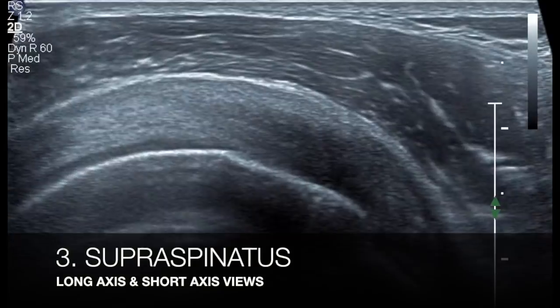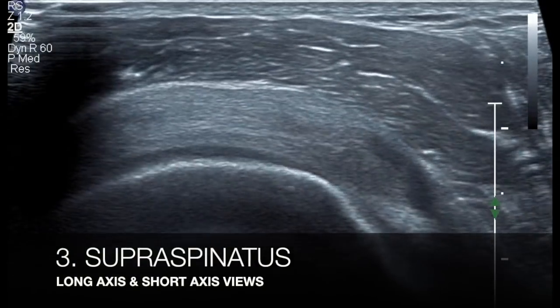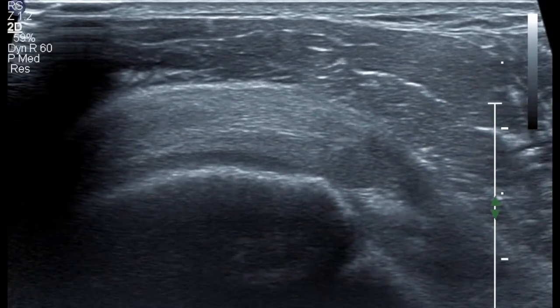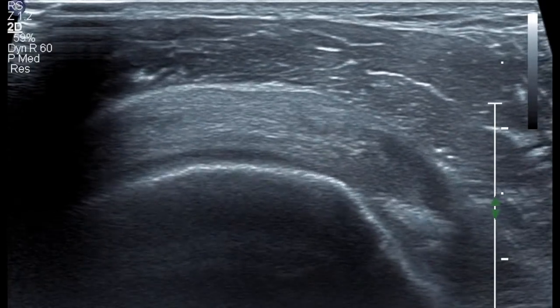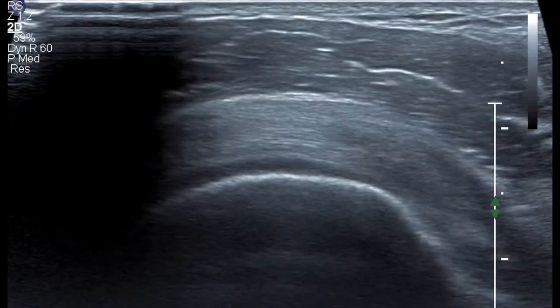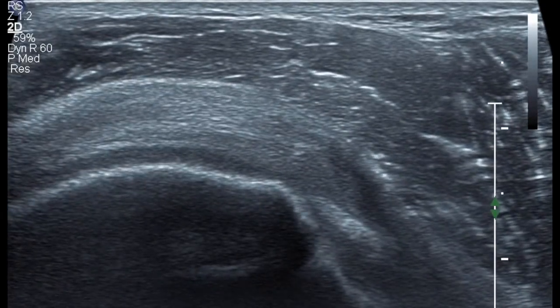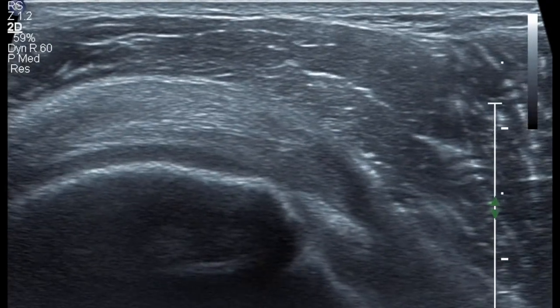For the supraspinatus, which forms the bulk of the referrals, you need to keep the hand in a modified Crass method. As seen in the video, your hand should be in the back pocket with the elbow as parallel to the torso as possible.